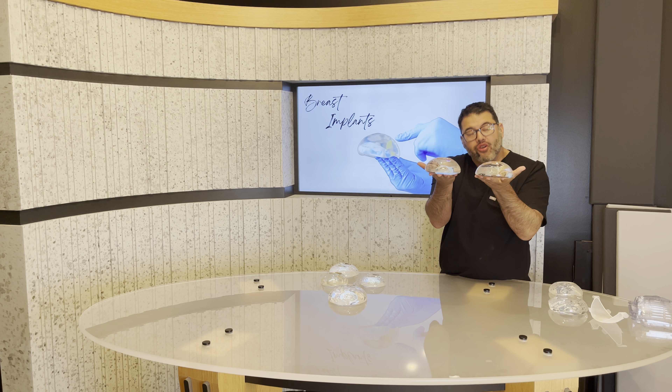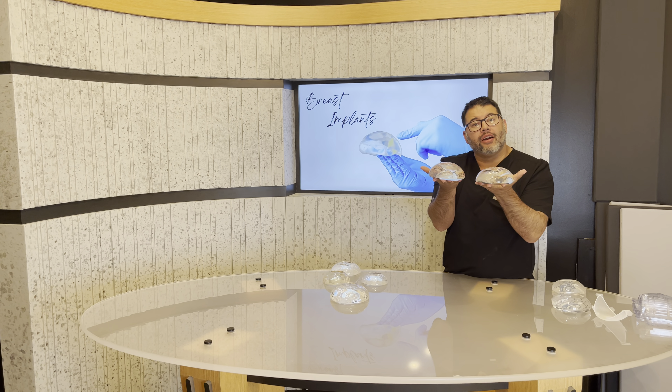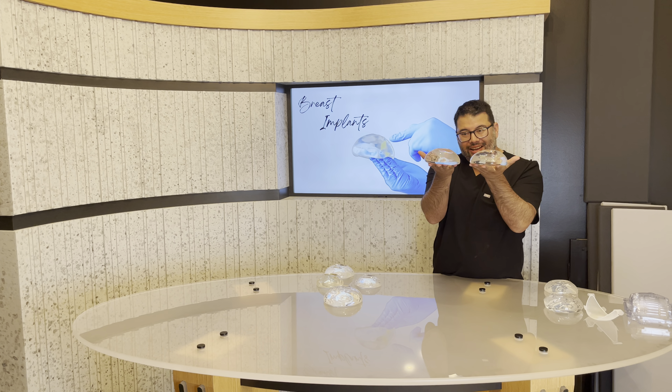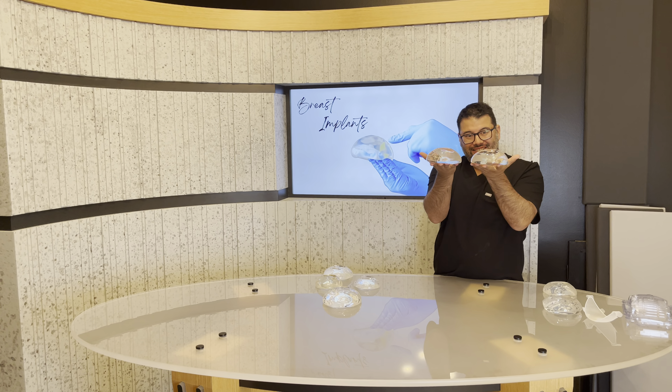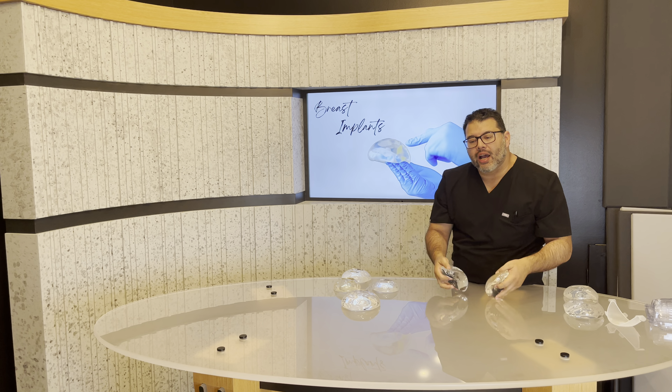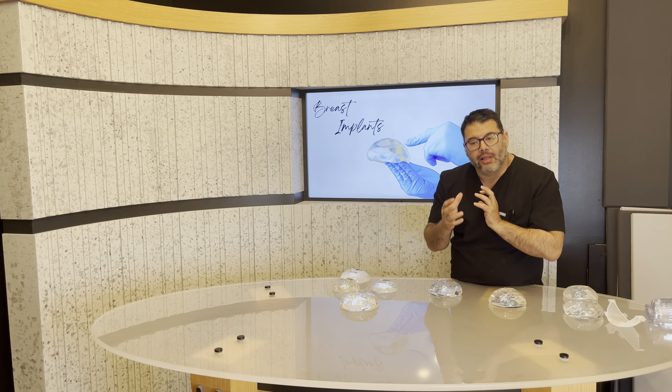This is a neat little challenge. Maybe we'll do something and see if you guys can tell which is which. One of these is our normal gummy bear, and one of these is the gummy bear plus. They're both the exact same size, both high profile, both smooth round implants. And so you can see some very subtle little differences from one to the other.